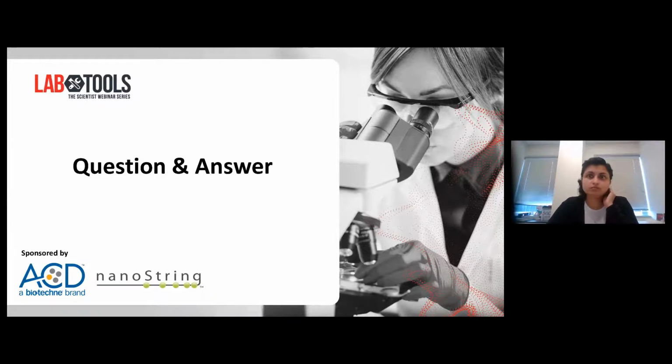And so you can use up to 4 different fluorescently labeled morphology markers to detect your regions of interest. Taking that one step further, if you have other images on serial sections or things you've done on other microscopes or on other scans, you can actually overlay those images on top of the image that you're working with on the DSP.